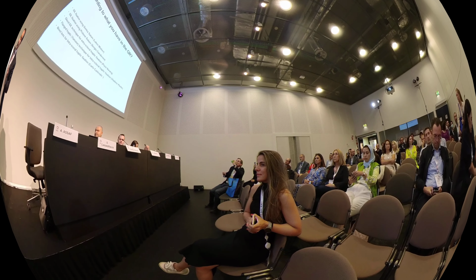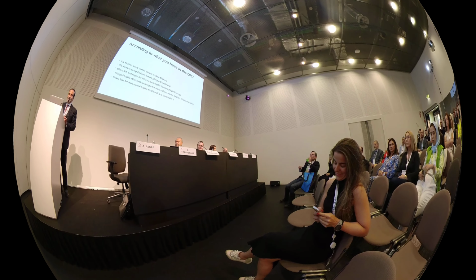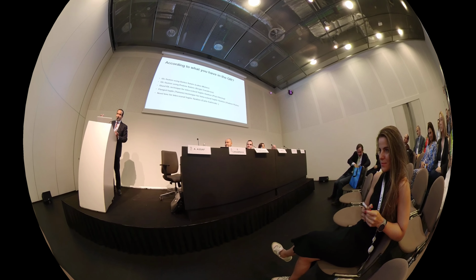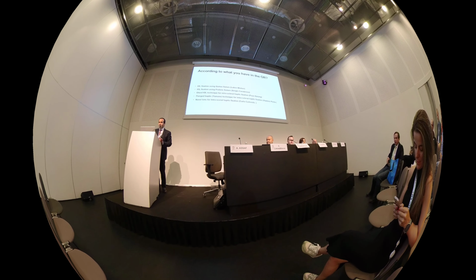And then Carlo Carnevali will talk about the fancy lens that he made by himself. This is the novel lens for intrascleral haptic fixation. If you have the chance to get this lens, or you have predicted that you might have a problem in this case, and you have the lens available in the OR.